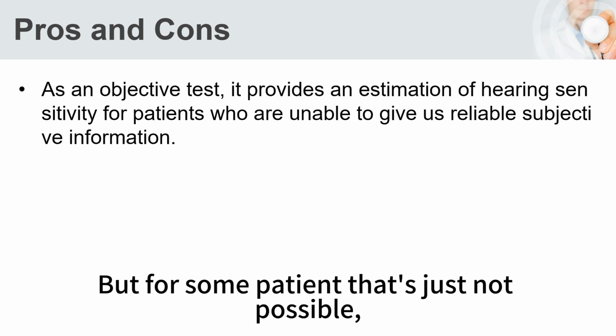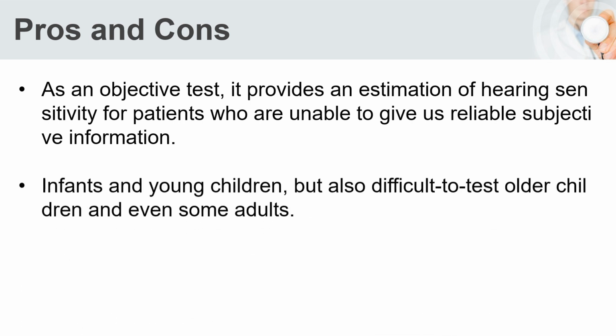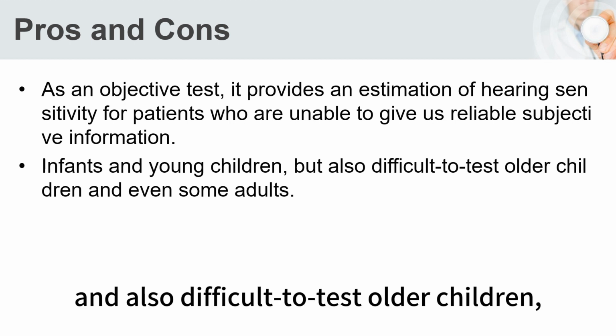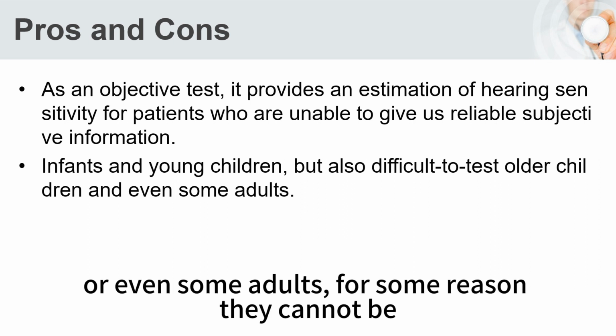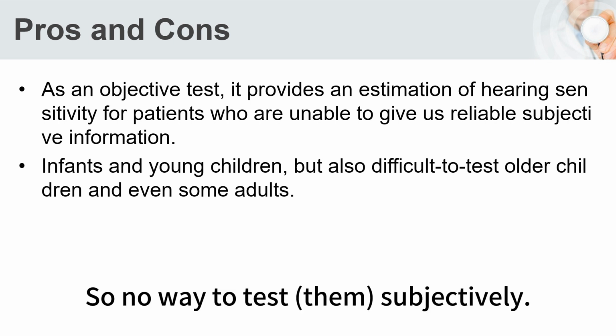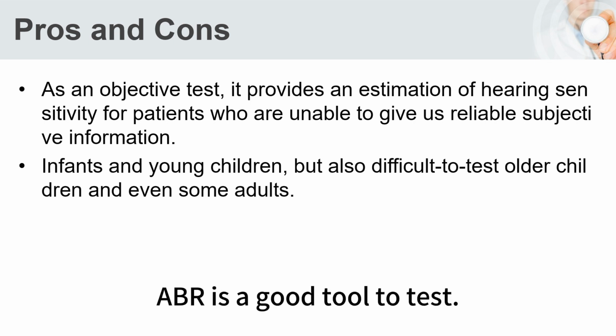But for some patients, that's just not possible, including infants. So infants and young children, and also it is difficult to test older children, or even some adults. For some reason, they cannot be tested by asking. So there is no way to test subjectively. In this scenario, ABR is a good tool to test.